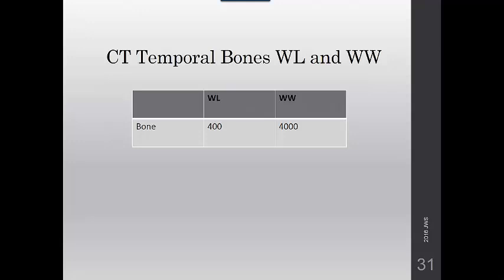As I said, the temporal bones are submitted in a very wide window setting with a 4,000 window width and a 400 window level. You'll see the images are almost grayed out, but it shows those tiny bones really well in that window level.